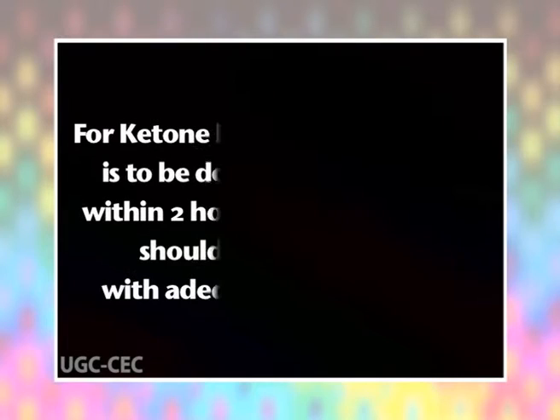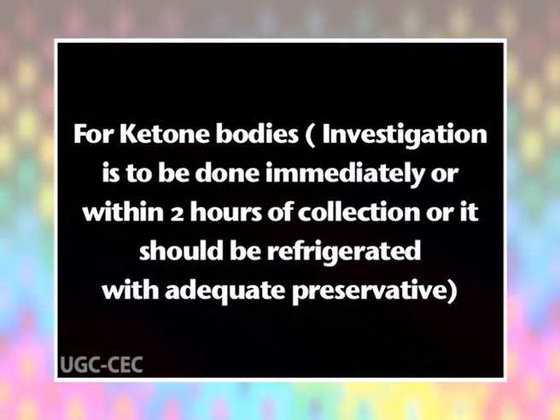They act by lowering the pH and by releasing formaldehyde. For ketone bodies, investigation is to be done immediately or within 2 hours of collection, or it should be refrigerated with adequate preservative.